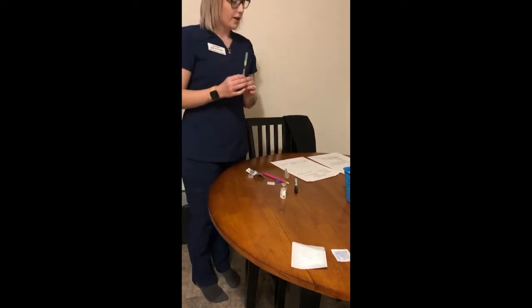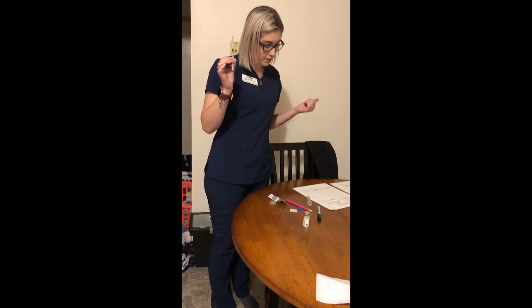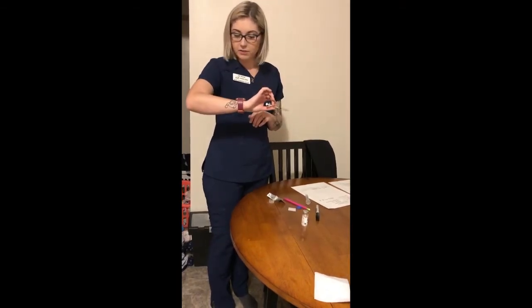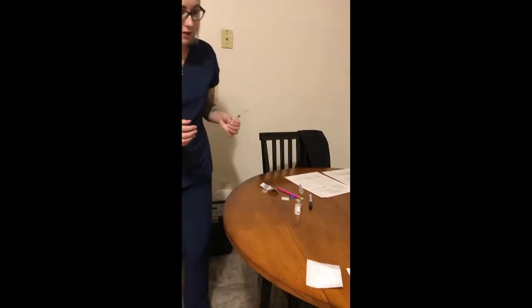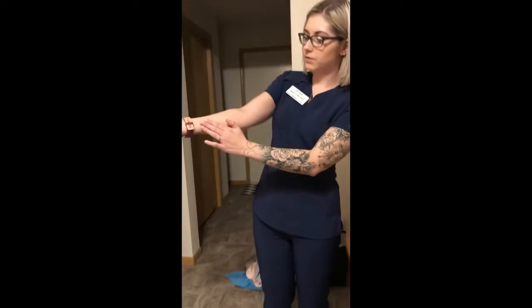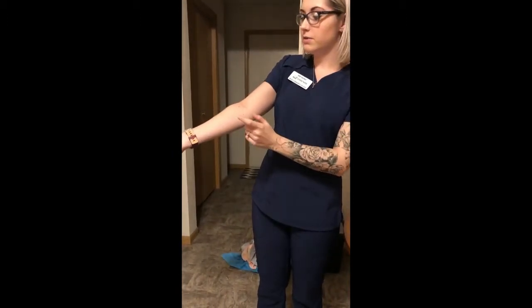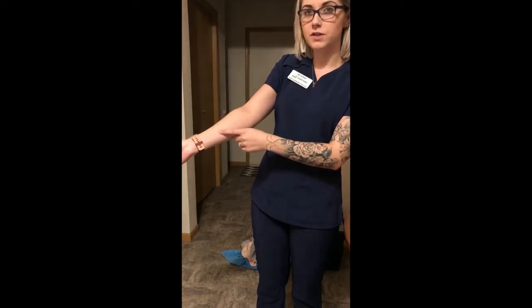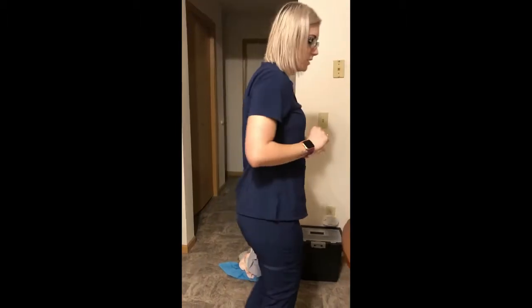I'm going to check that I have the right patient, the right medication, with the right dose, it's the right time, and the right route. So I'm going to explain the routes for the intradermal medication. So the intradermal injection, you want to put it here on your forearm. You don't want any moles or tattoos where you put it. Or you can put it on this part of your back.